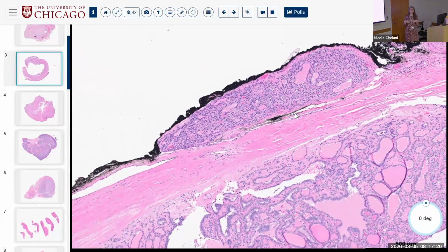What's another thing that you could do that we can't do because we don't have this functionality here, but if you did, do RAS, exactly. So the immunostains that are helpful for thyroid are BRAF V600E stain, right, which will tell you if there's a BRAF mutation, and the RAS stain, which we don't have, which tells you if there's a RAS Q61R mutation. In differentiated thyroid neoplasms, those are the only stains that are helpful, right? So you may see on the outside people doing HBME and galectin and CK19 and all those antiquated stains, don't even look at them, just throw them in the garbage, all right?